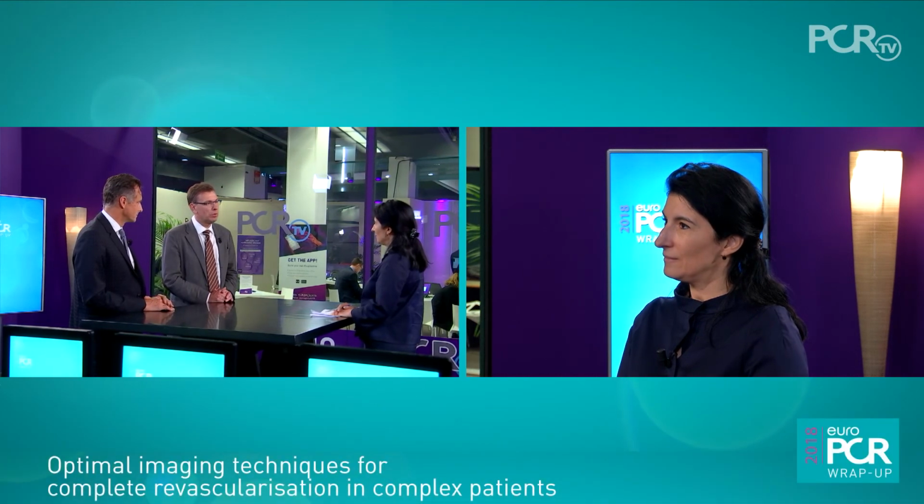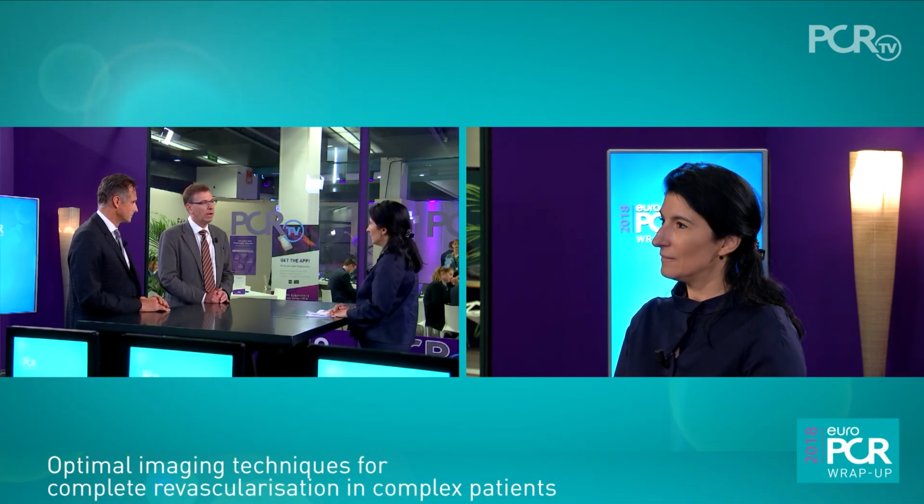This gives you a clear picture of the dimensions of the different branches, and it can give you more detailed information about the load and the distribution and the depth and the whole burden of the calcium. And this will give you an idea which preparation of the lesion is necessary and how many stents you will finally need to treat them properly.